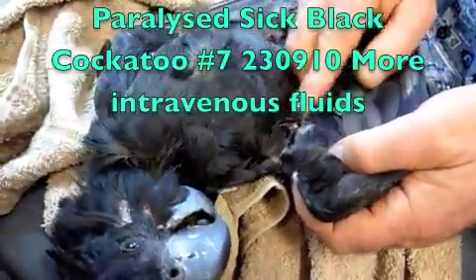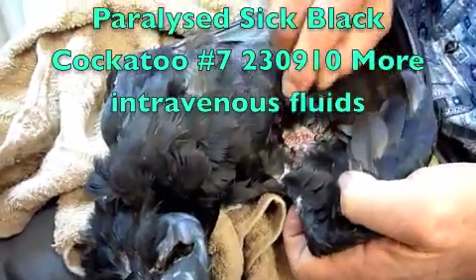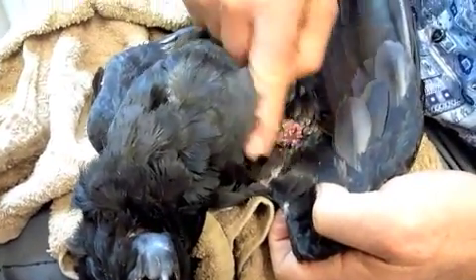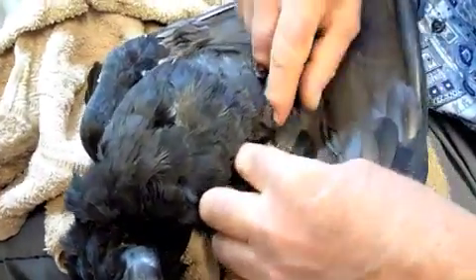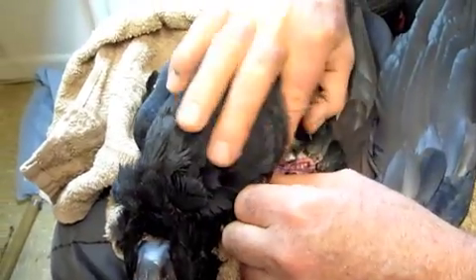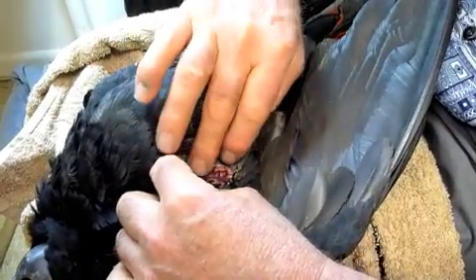I'm learning it's probably easier with some species than others, so it's not about playing around with it. I'll try up there rather than down here.